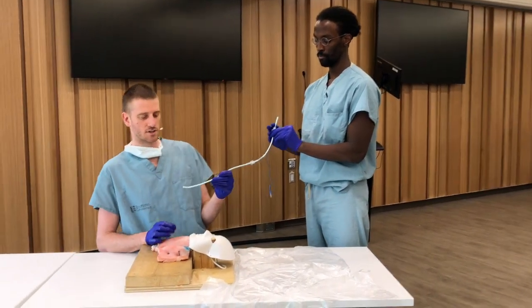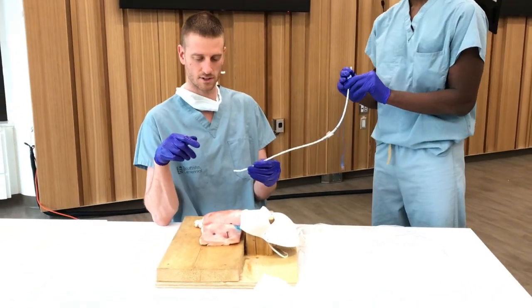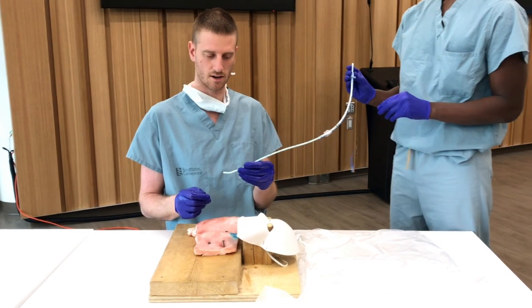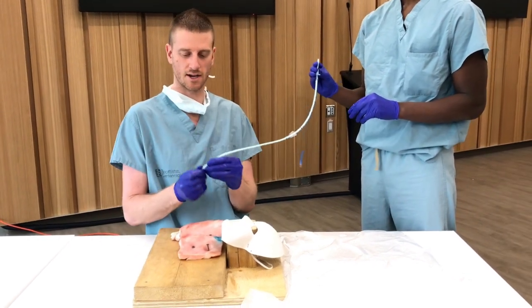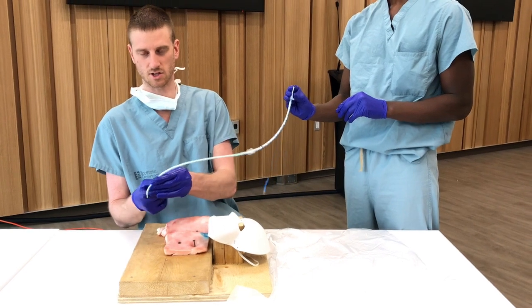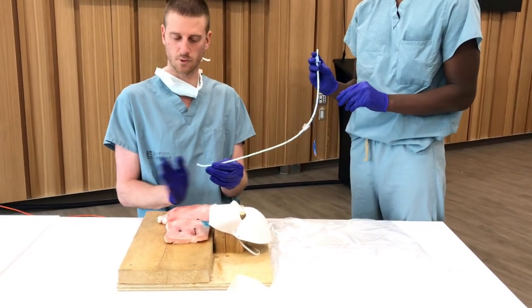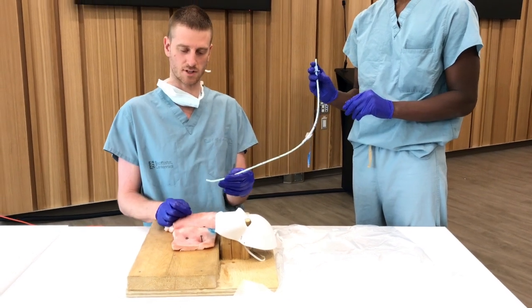The other detail you notice is that the coude tip of the bougie is pointed caudad, okay? As opposed to being upside down and diving down here. If we go into the trachea this way, we're not going to advance. We're going to get stuck on tracheal rings and it's not going to move along. Okay, so very important that that coude tip is pointing towards the feet and back up towards the sky.